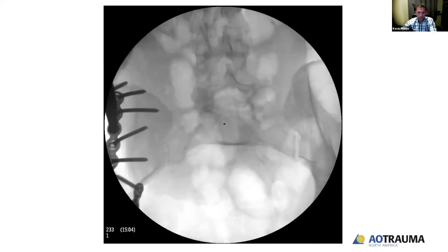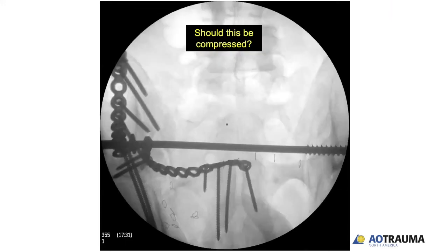We got an inlet view. The inlet view looked pretty good, like things were lining up well. Then I did an intraoperative spin at this point, and I don't have the images in here because our intraoperative CT scan just saves the axials. In the OR I manipulate the images to get direct axials, coronals, and sagittals.